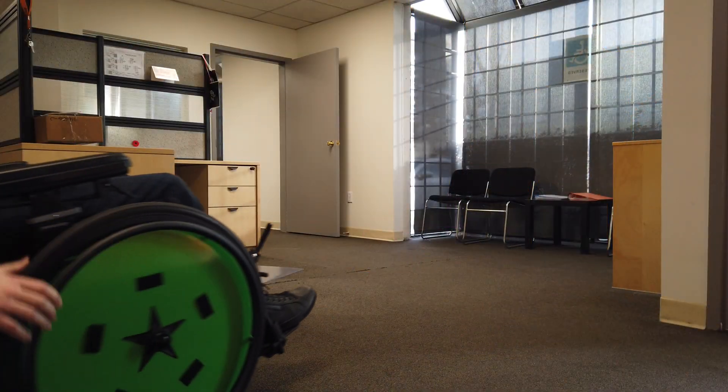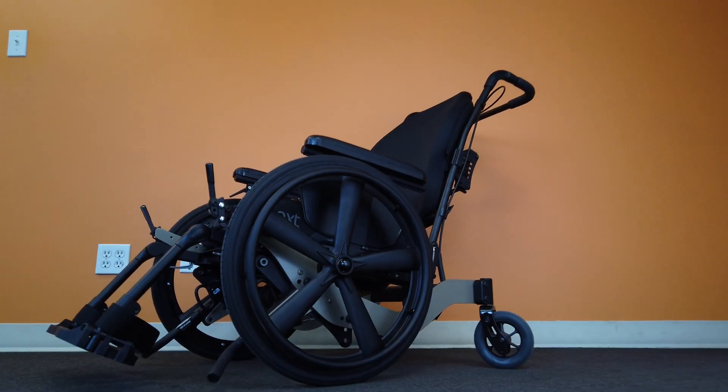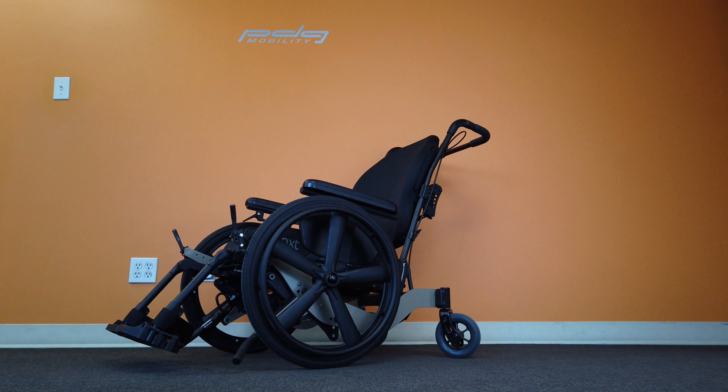The Bentley LTR is the latest innovation in PDG Mobility's line of tilt-in-space wheelchairs, aimed at improving the mobility of all our users.